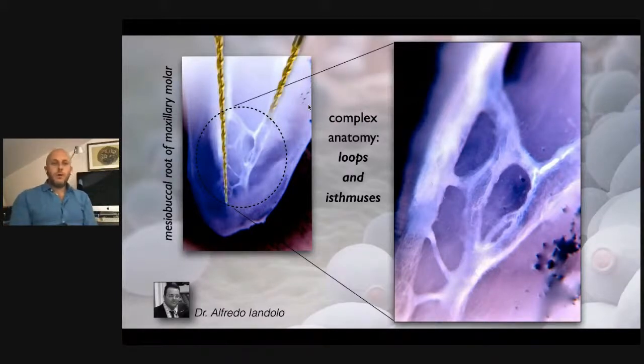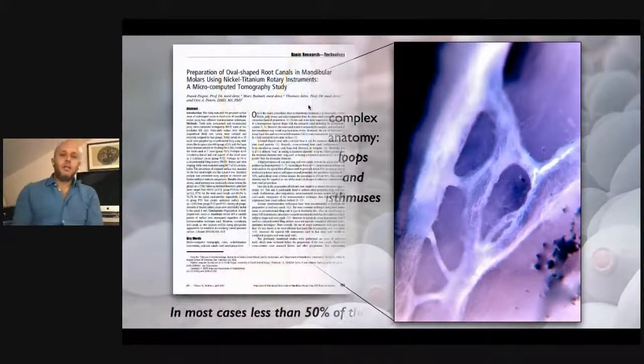Because when we shape root canals with rotary files or reciprocating files, we always have to remember that the action of each file is limited to the main canal, but they produce debris that can impact the lateral canals, can impact the anastomosis between different canals, and we have to remove all the debris, all the bacteria, only with the aid of irrigating solution.